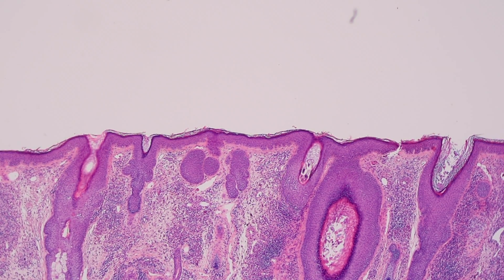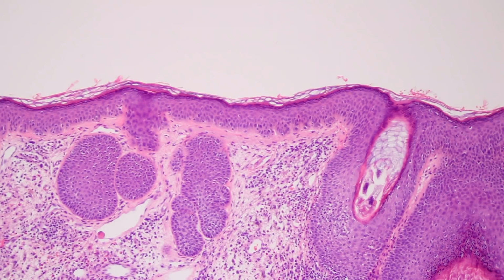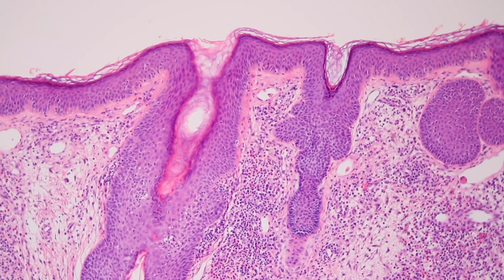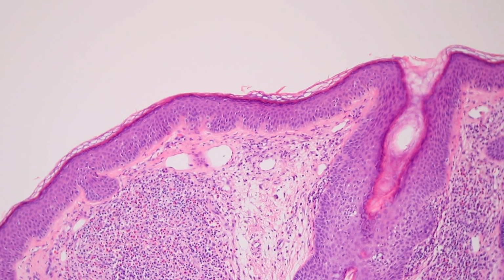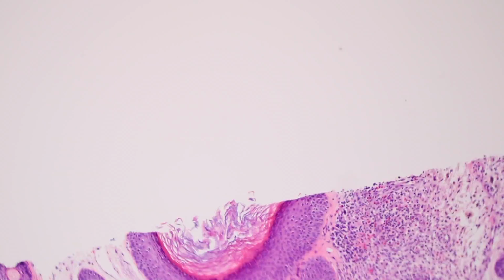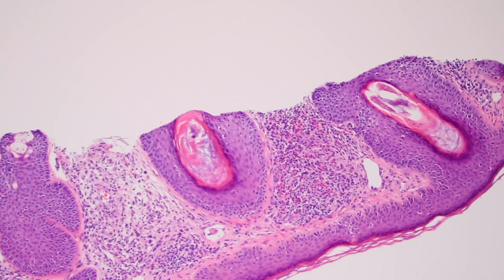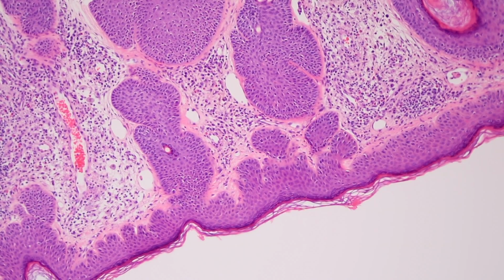So people call this in dermpath a Grenz zone. And the Grenz zone I find to not particularly be a very useful concept, because a lot of things that are supposed to have a Grenz zone don't always have it, like dermatofibroma, for example. But in this particular entity, I think the Grenz zone actually is useful because it's almost always there. There's a bunch of inflammation in the dermis, but then there's this little thin layer of normal separating the epidermis, which is totally uninvolved, which is surprising for as much inflammation as there is in the dermis, that you really don't have very much change at all to the epidermis.